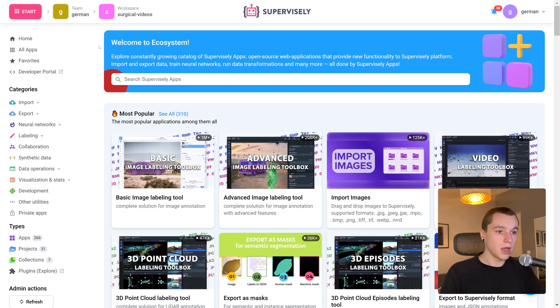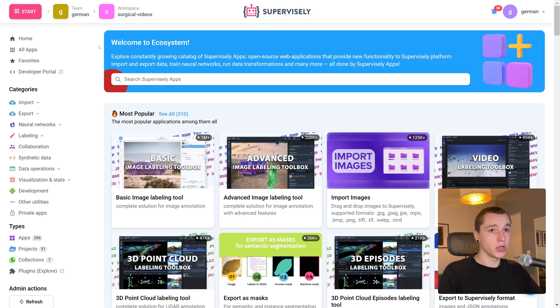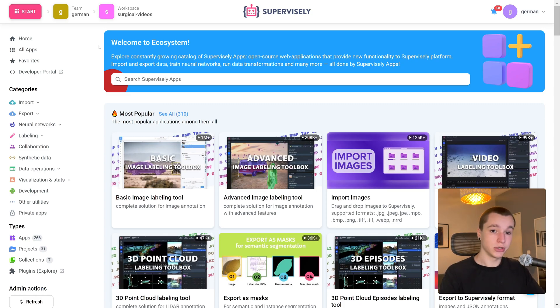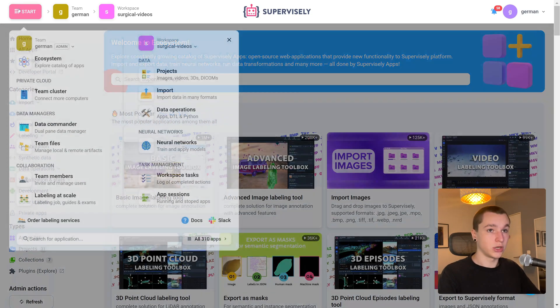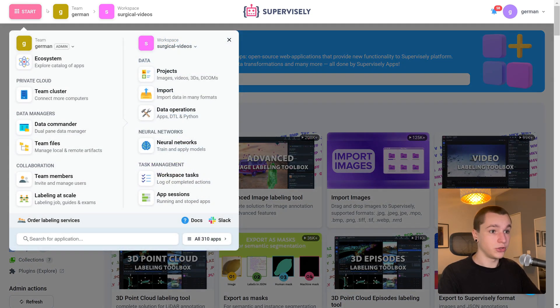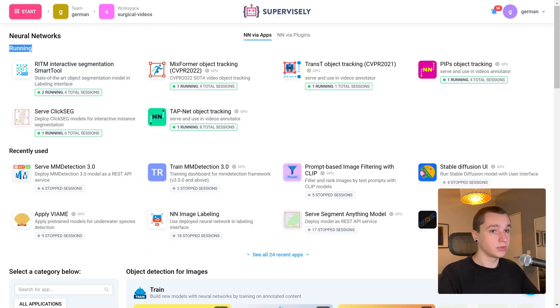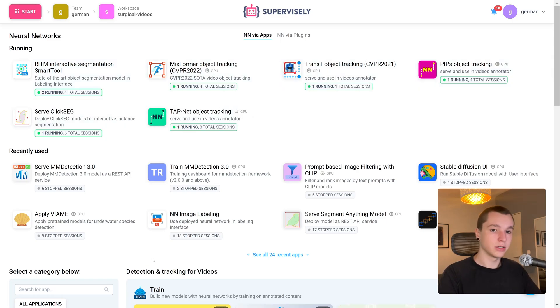But before we do that, I would like to show you how to deploy a neural network on your device in order to use it in the platform. First, we need to go to the Start menu and find neural networks. In the running tab you can see all the neural networks currently deployed on your device. For this video I will need two types of neural networks deployed.